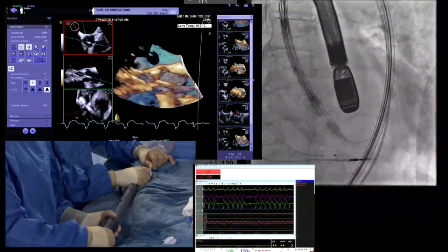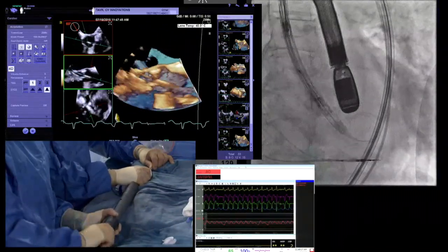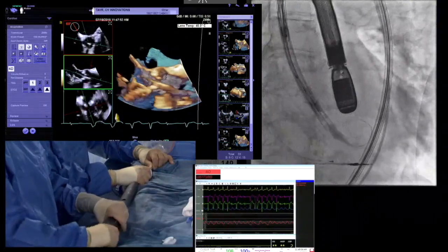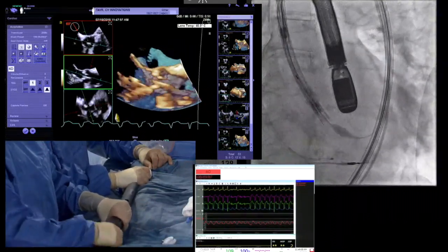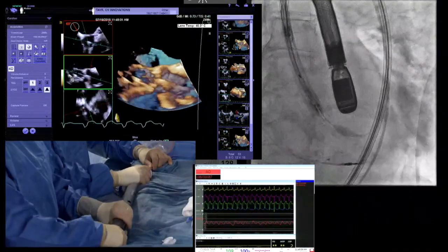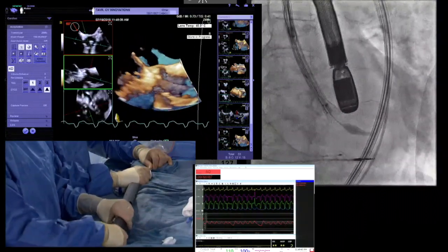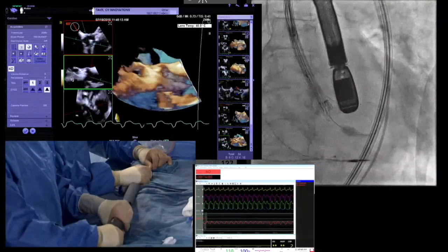So we're going to start unraveling, and it's going to dive just like a CoreValve will. And when they talk about letting the valve get about 6 millimeters below the annulus to start, and then it will retract from the ventricle up to about 3, that's our goal. Another thing to keep an eye on is actually those tuning forks. We want to keep them centered on our pigtail. So a combination of those two things is what we're going to shoot for. Now we're starting to see it unfurl a little bit. And this valve, we don't expect an early grasp, not a lot of calcium here. So I like your depth, Bob.